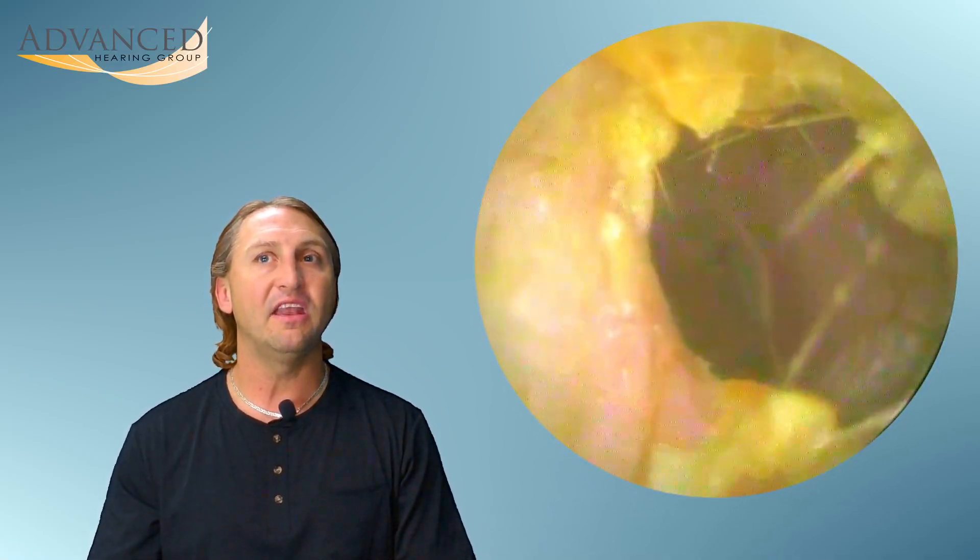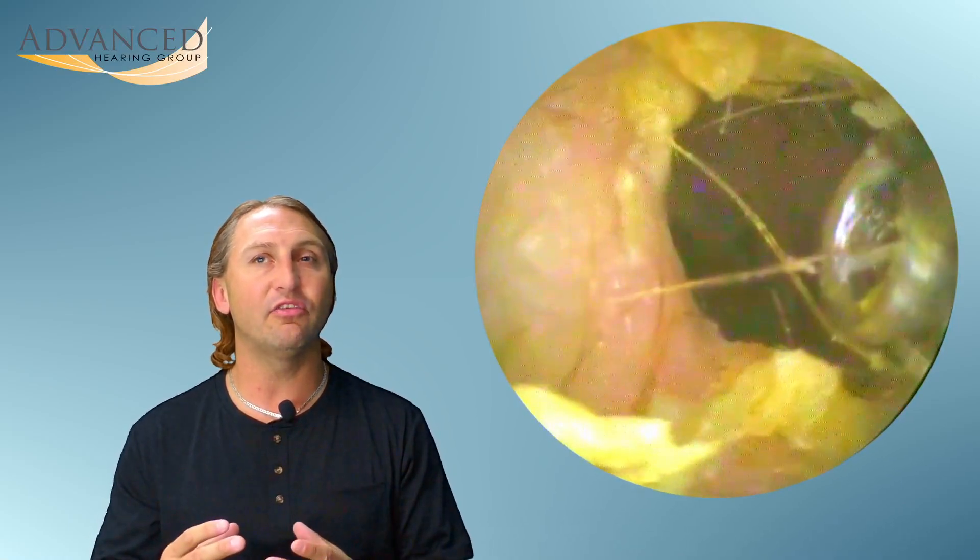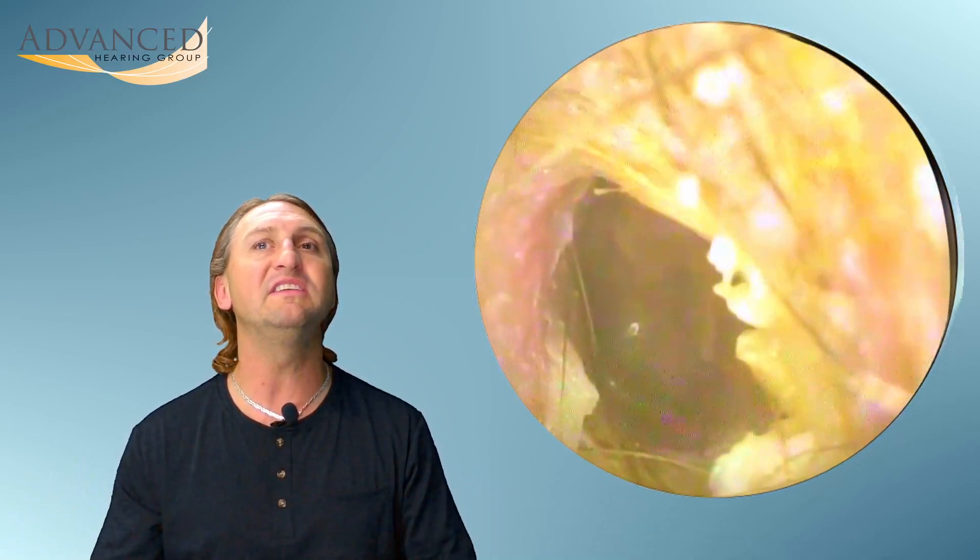Moving on to our second patient, you can see just a very different consistency of this earwax. The curette's not going through it as quickly and it came out almost like a ball. That nice yellowish color there is a great healthy color for earwax and it really stuck together well. This buildup was not long going, it must have been recent. There's another good view of the eardrum.